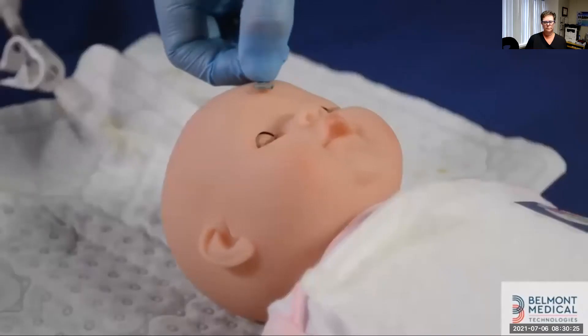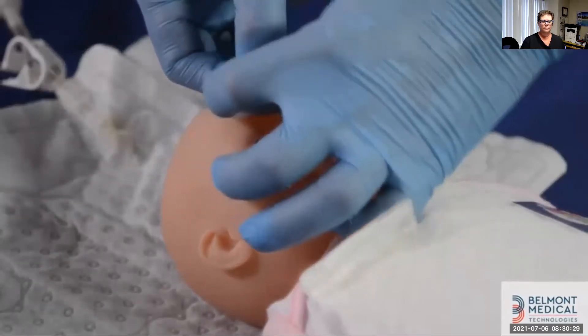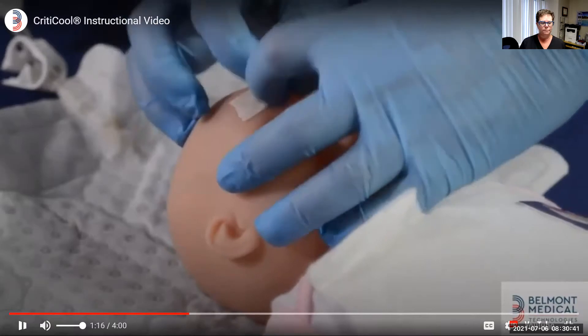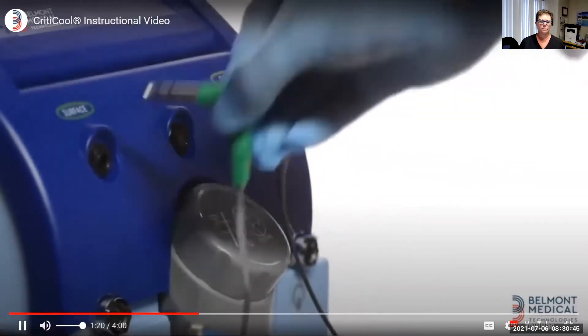Position the core and surface temperature probes. The patient's core temperature can be measured via esophageal or rectal temperature. We will continue to use bladder temperature as it connects nicely into the core probe. Connect the temperature probes, gray for core, green for surface.